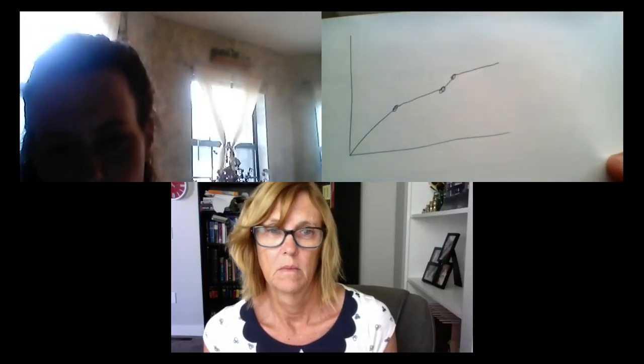I'll give you a neat point. Look at that. It has linear, then WDRC, and then a little bit of linear again, and then output limiting. Weird. They'll have 3 knee points. Yikes! Don't worry about it. You're not setting it. Software does that. Okay? But that's actually what happens in linear in some of these hearing aids.